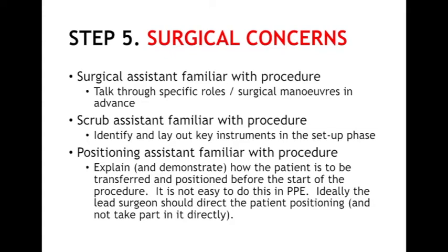If necessary, this should be simulated outside of the patient environment before donning PPE, as communication and movement in aerosol protective PPE is difficult. As mentioned earlier, we recommend that the surgical team direct rather than are specifically involved with the physical placement of the patient, not least to retain the sterility of their PPE.